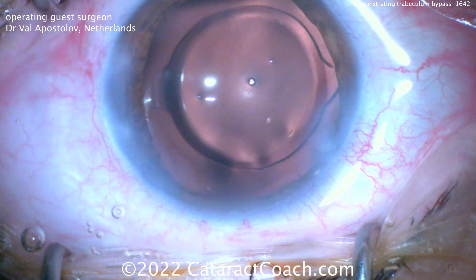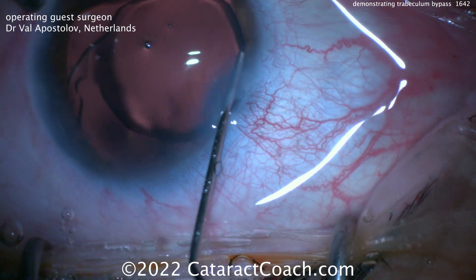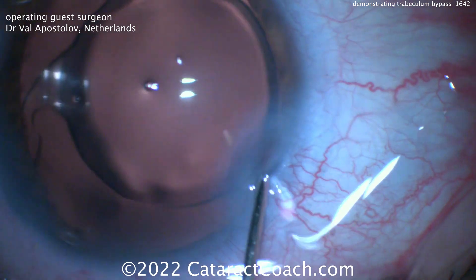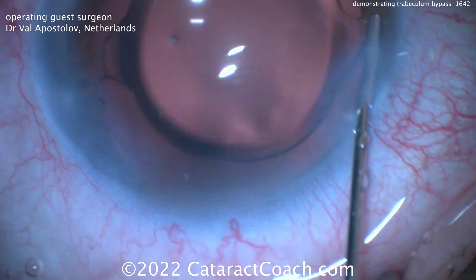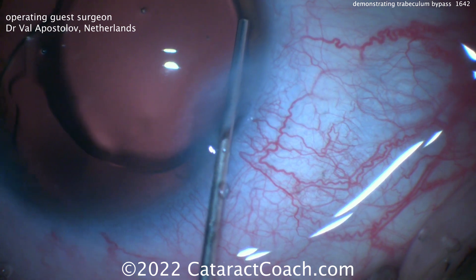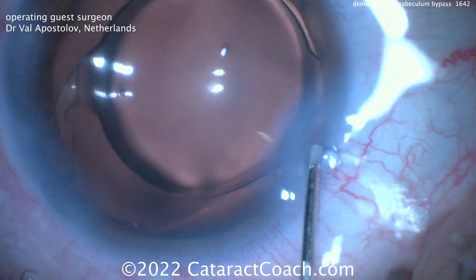You're bypassing that trabeculum, which doesn't flow as it should — or at least not sufficiently for the patient's condition. I encourage all cataract surgeons to certainly learn how to use the MIGs procedure, especially if you're a young surgeon. You can learn this during your residency training, and it's something you may find useful for many of your glaucoma patients who have concurrent cataracts. You can do the cataract surgery and the MIGs procedure in the same sitting.